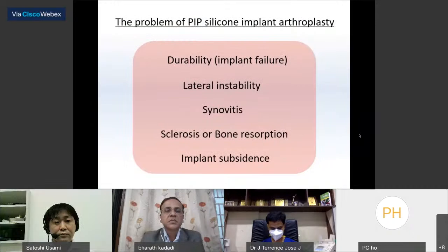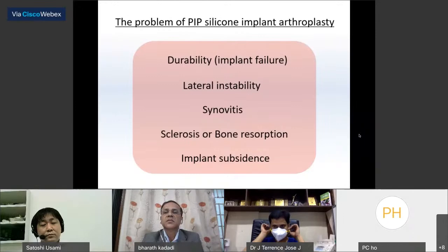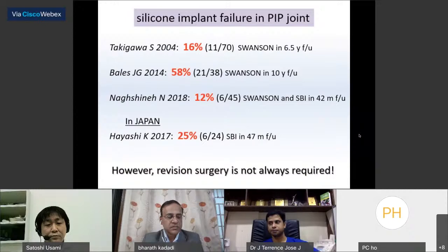Several problems of PIP silicone implant arthroplasty were reported, that is, durability, lateral instability, synovitis, sclerosis, bone resorption, or implant subsidence. Especially, implant failure is one of the unavoidable complications in the long term. Previously, various rates of silicone implant failure were reported, and it mainly depends on patient sex, lifestyle, and occupation. Inconveniently, it is sometimes difficult to identify implant failure only in X-ray appearance.